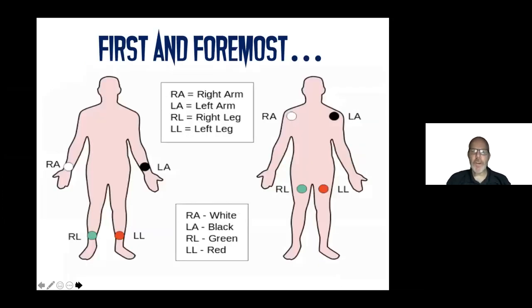So first and foremost, let's talk about lead placement, okay? Because everything that we're going to talk about from this point forward is predicated on proper lead placement. So many of you that are listening to this today do not normally read EKGs. It's not within your skill set. It's not within your training, but many of you are taught to apply leads and acquire an EKG. It doesn't take a paramedic to put leads on and acquire an EKG. However, if you want an EKG of diagnostic quality, then your leads have to be placed correctly.